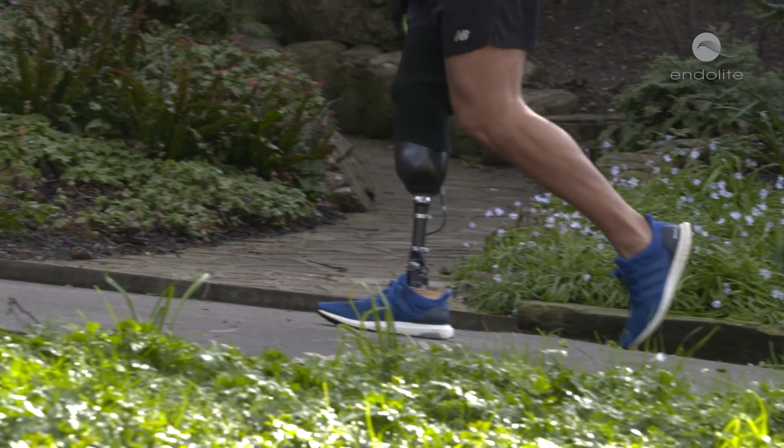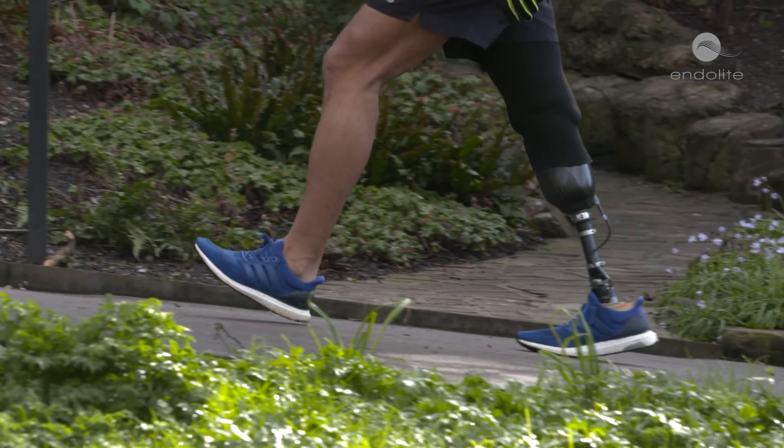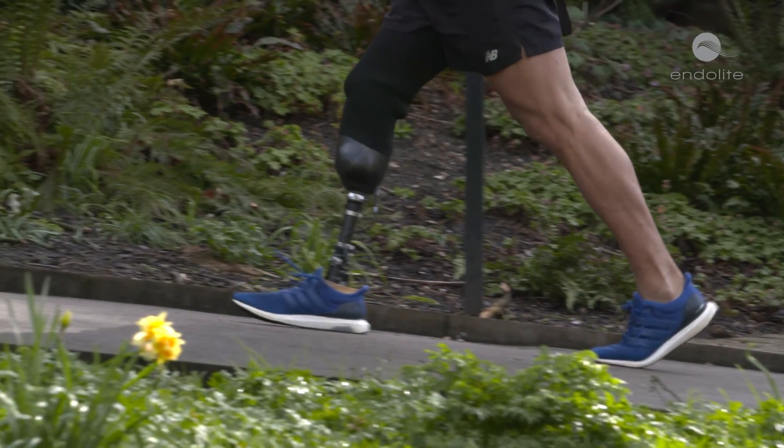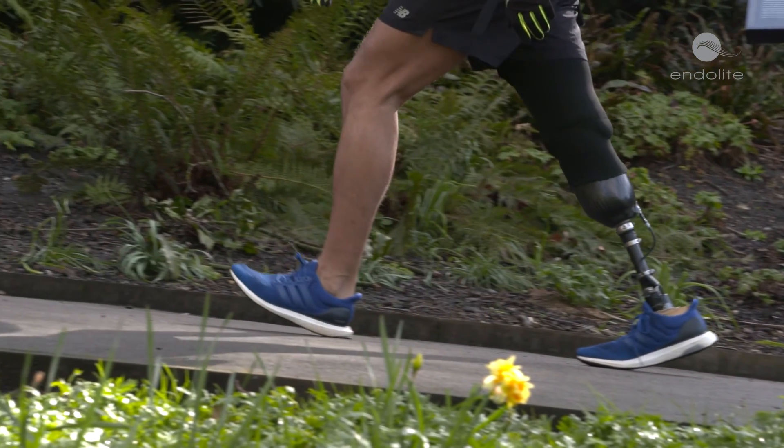Coupled with the advantages of elevated vacuum, there's a more solid connection. Because we've got a better connection, there'll be less relative motion between the stump and the socket, leading to a reduced risk of falls. There's also strong evidence to show improved wound healing with elevated vacuum.